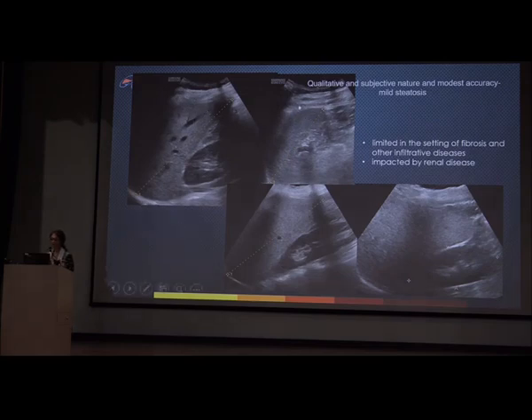This is the spleen, just for comparison, and that's the liver raised in comparison to the kidney. Now in this liver, it seems brighter than the last one, so it is moderate, and this is severe steatosis because we can't see the borders of the diaphragm. We can't even see the posterior outline of the liver, and this is much, much brighter than the kidney.